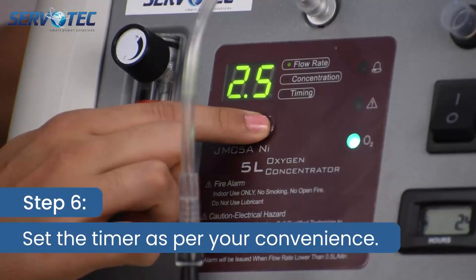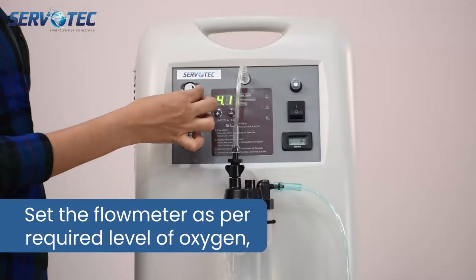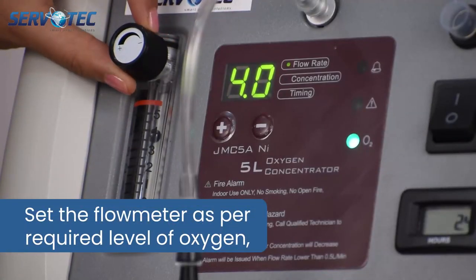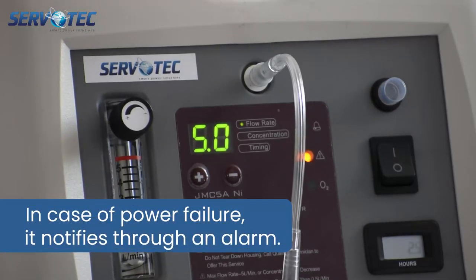Step 6: Set the timer as per your convenience. Set the flow meter as per the required level of oxygen. In case of power failure, it notifies through an alarm.